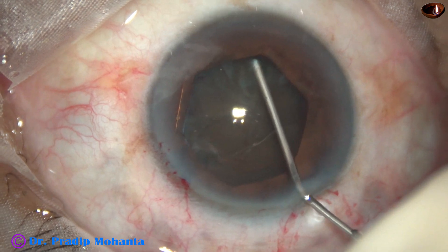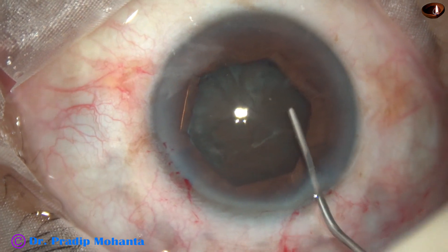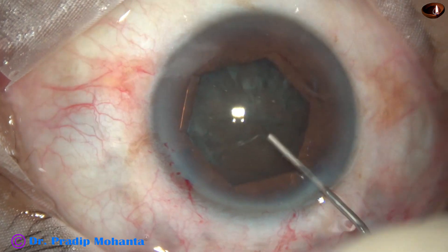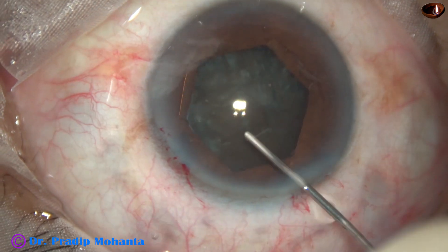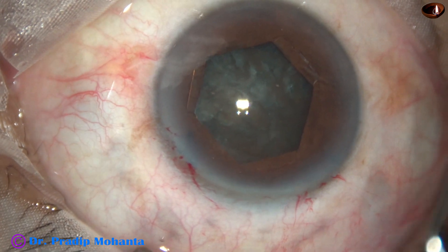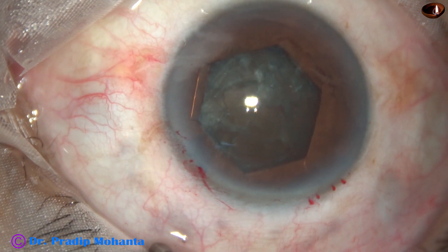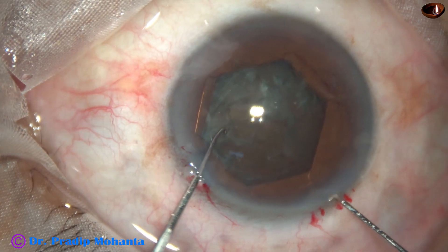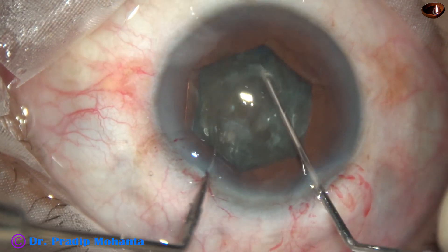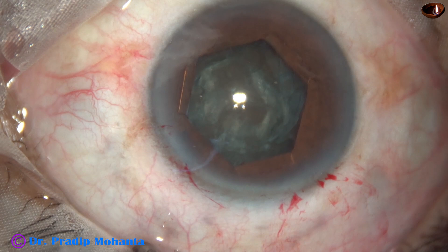Hydrodissection is done. Small aliquots of BSS are injected underneath the anterior capsular rim at multiple points. The anterior surface of the lens is tapped gently, and when I can make out that the nucleus has been freed from the capsule — though in some places it may still be attached — I use two hooks and rotate the nucleus bimanually. Zonular stress is much less if we rotate the nucleus bimanually.